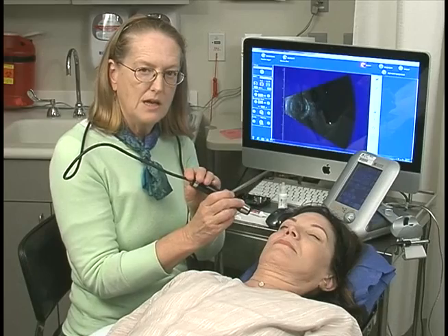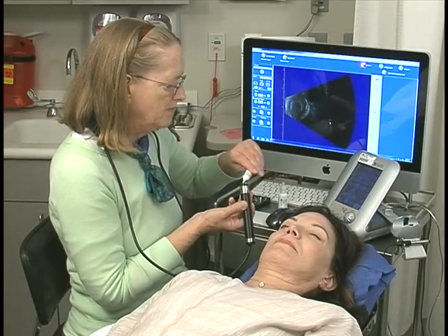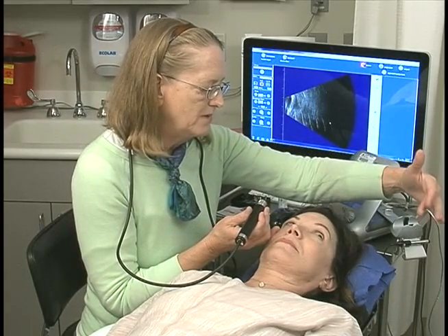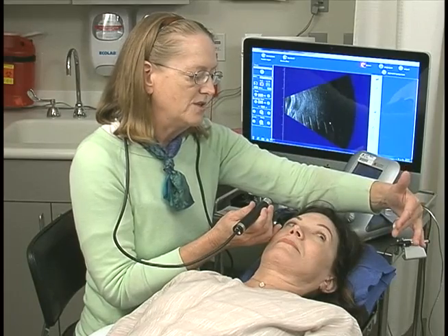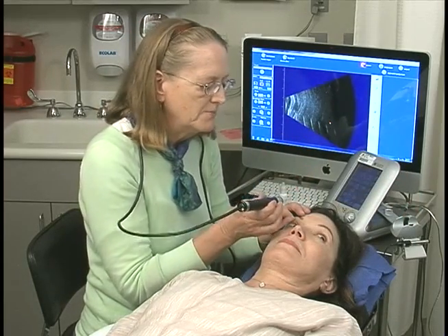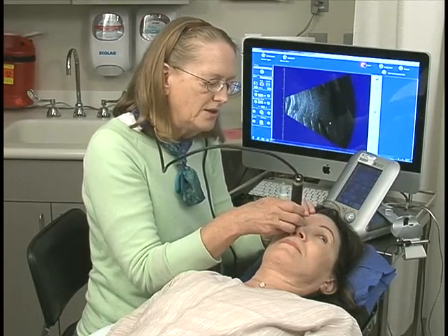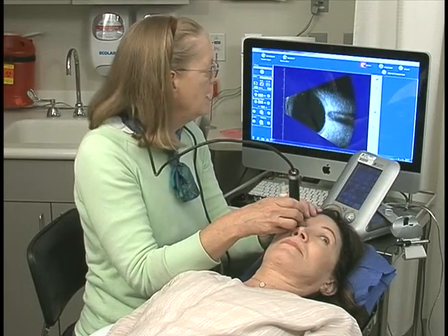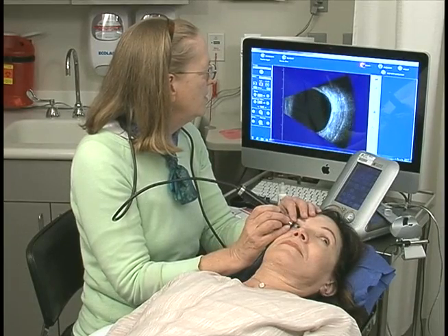We'll do exactly the same two scans for transverse but for vertical. Now the marker will be placed superiorly. I'm going to have you open your eyes and look to the left. Most patients don't look where you want them to when their eyes are open, and they certainly have a hard time when the eyes are closed. That's why the majority of ultrasounds are performed on the sclera, unless there's a case of recent surgery, trauma, etc. She's looking to the left, at 3 o'clock. I place the probe vertically on the temporal limbus — there's the optic nerve, now showing superior-inferior orientation. I bring the probe out to equatorial and all the way out.